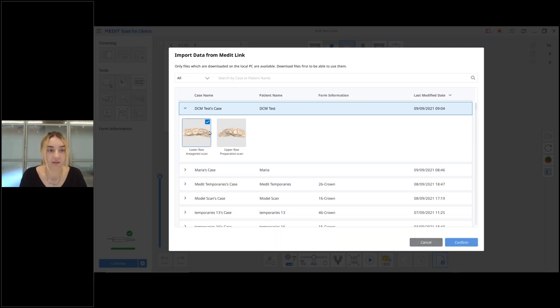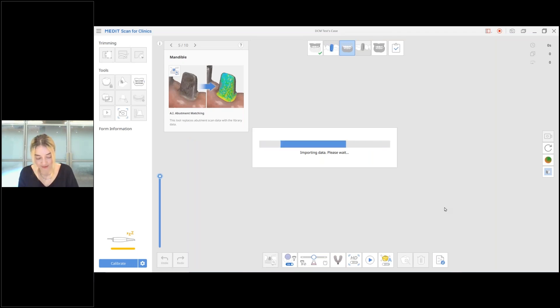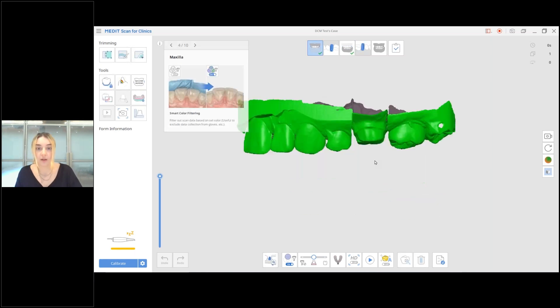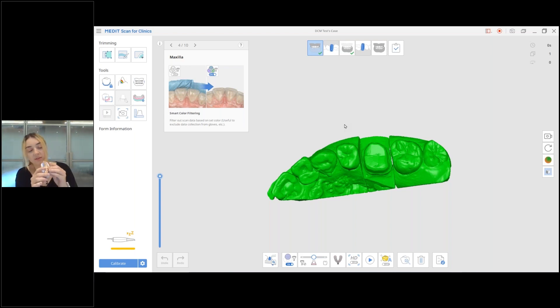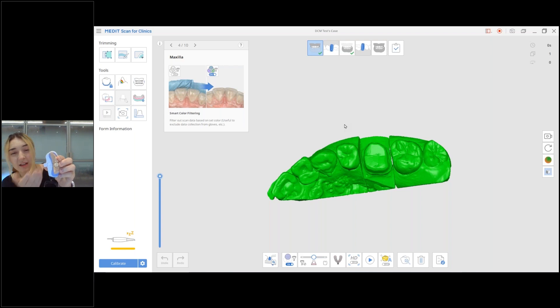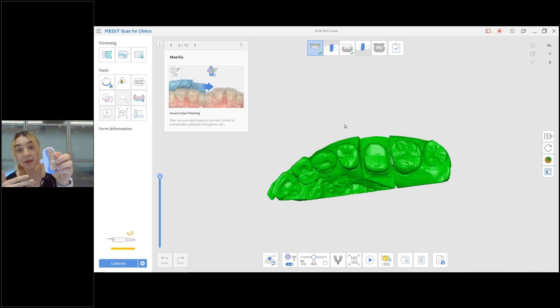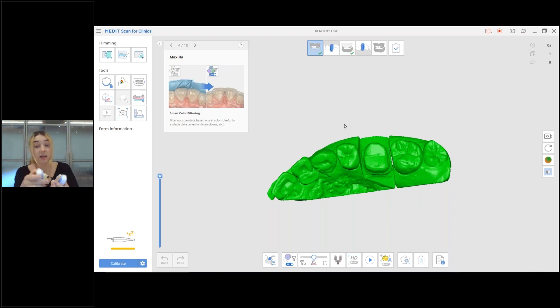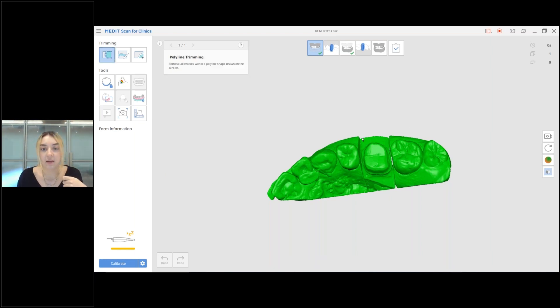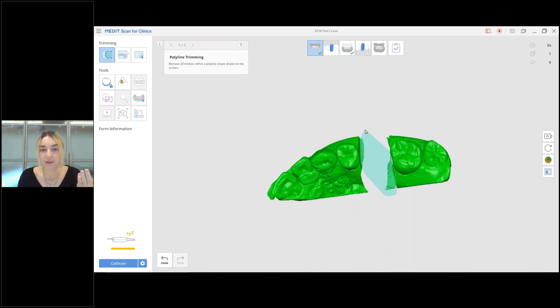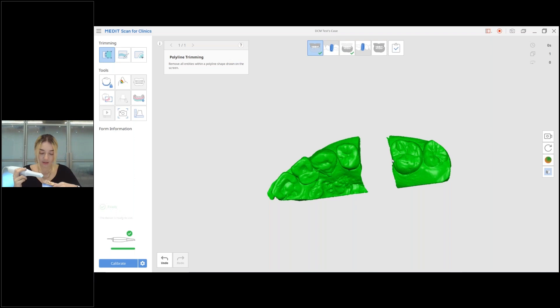I have it attached to my MediLink case. I'm going to click on it and I have it right here, upper jaw. You select the upper jaw once you've had the stage at the top selected. Many would have expected the scan data to appear right here on the corresponding stage, but it doesn't work like this because it's not the data that you've actually scanned in Scan for Clinics. That's why you have to use this button. Here I have my upper jaw. I'm going to go to mandible again and use this function and I'm going to import my lower jaw scan. For example, the upper jaw file that you see here has a prep tooth. Imagine that I did a diagnostic scan with 3Shape scanner and then I saw a patient another day and I prepped my patient and I wanted to scan in order to make a crown or create a case to send to a lab.